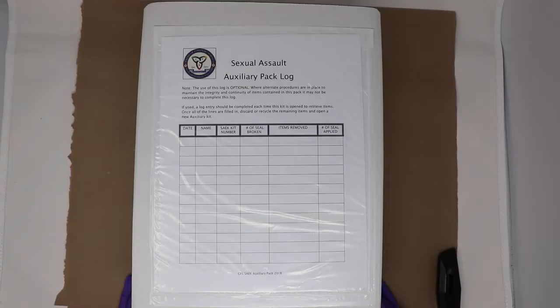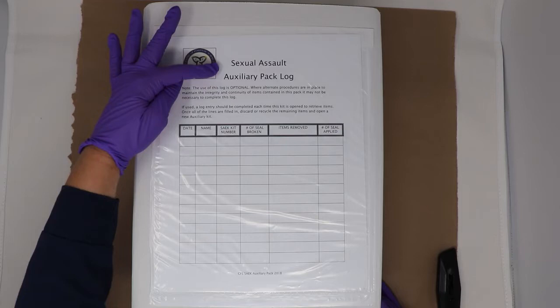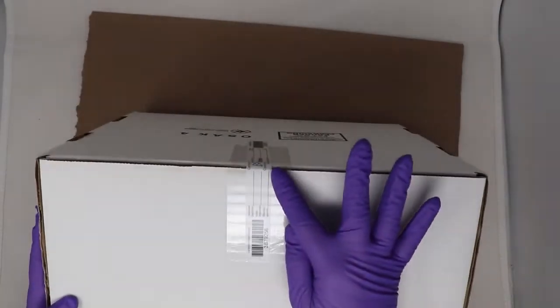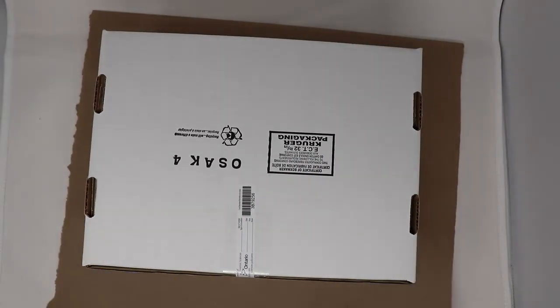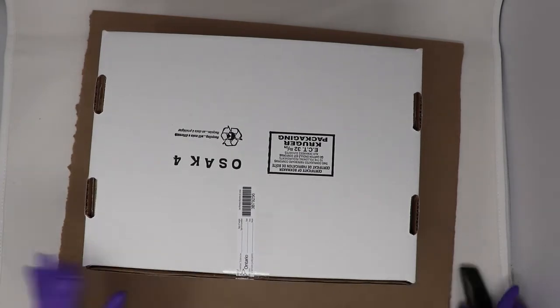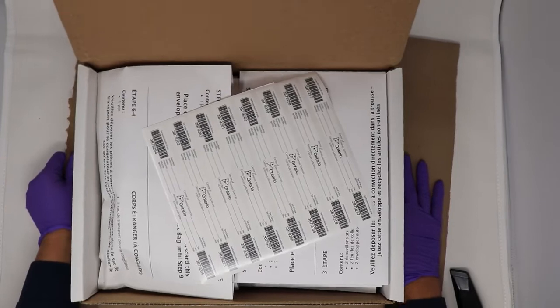The auxiliary pack contains items that are less frequently used and is designed to supplement multiple examinations. As such, it has a log on the outside that is meant to be completed each time the seal is broken. When collection of items from the auxiliary pack are required, the examiner breaks the seal to the auxiliary pack and removes the items required for the examination using clean gloves. There are seals provided to reseal the auxiliary pack.